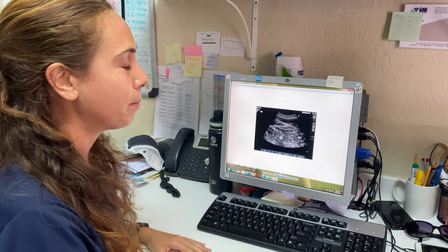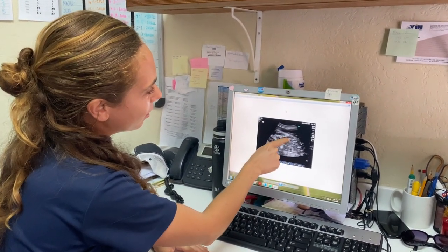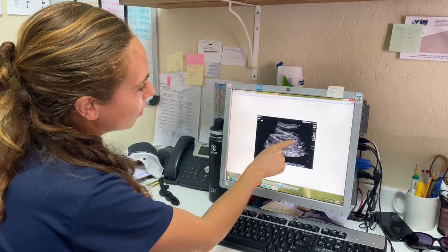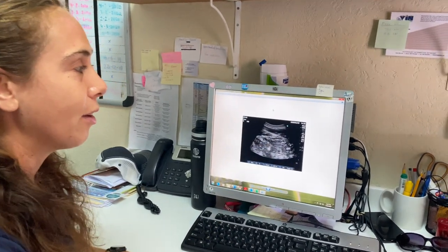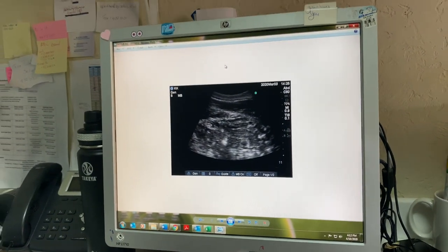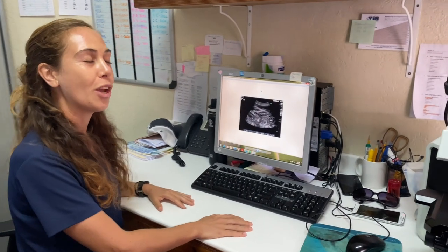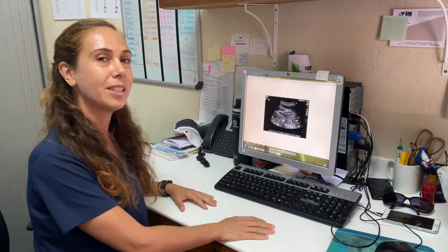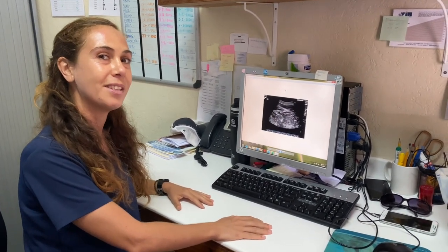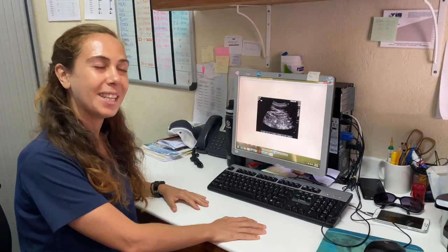Specific location in the body, so we always know where to find it. And do you see these little black round circles? These are basically follicles that are developing. Once one of those follicles reaches about 1.5, 1.6, they ovulate, and then that egg is ready to be inseminated. And if she is with a fertile male, she'll have a new baby. But it didn't happen this time.